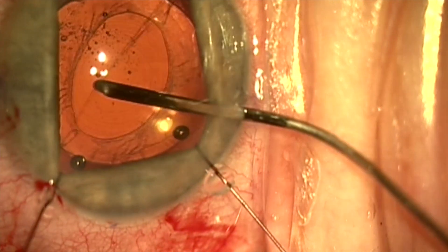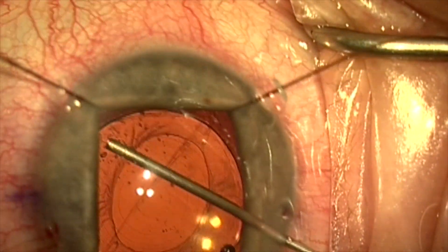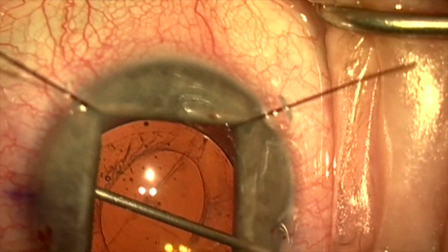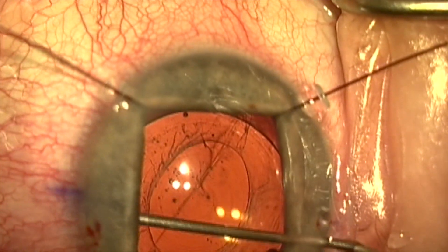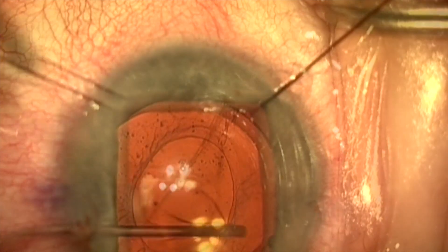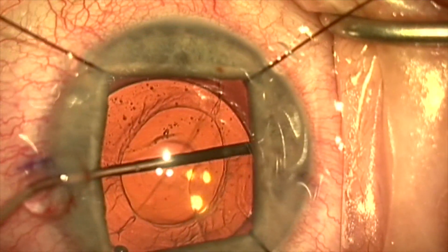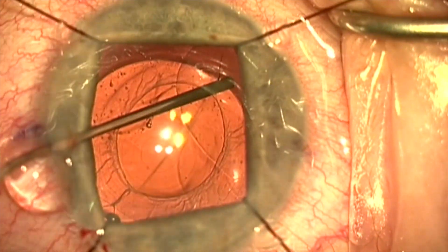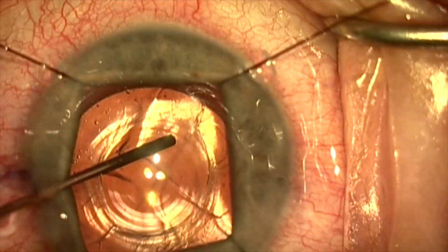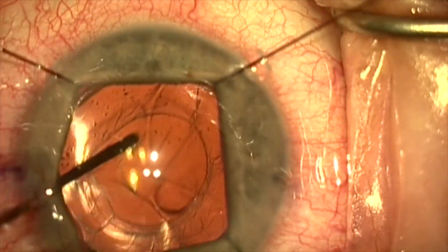We're trying to reopen the capsular bag using a LASIK cannula. We can see that the zonules are pretty weak here and the lens is pretty socked in. We start with dispersive viscoelastic and then switch to cohesive viscoelastic once the anterior capsule is separated from the optic. Now we're just trying to visco-dissect the bag open and get the lay of the land here, so to speak.